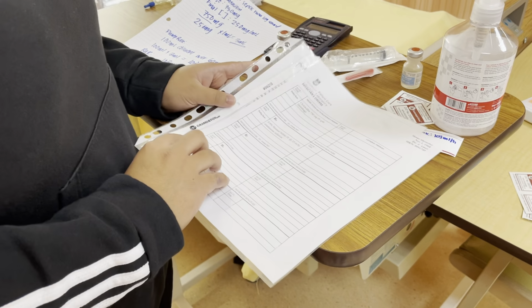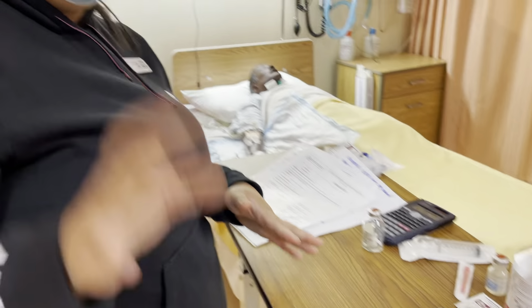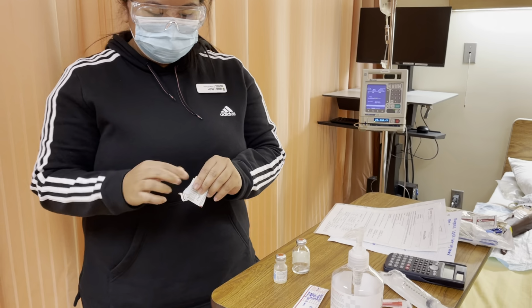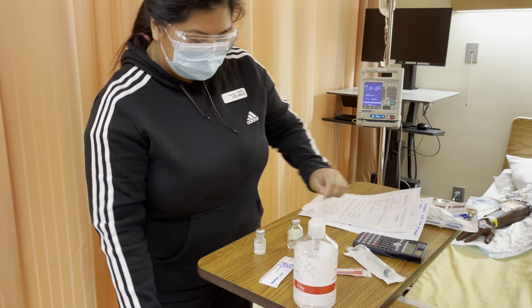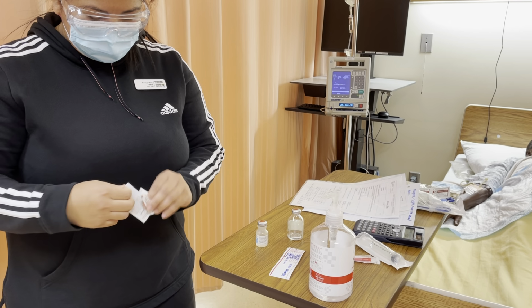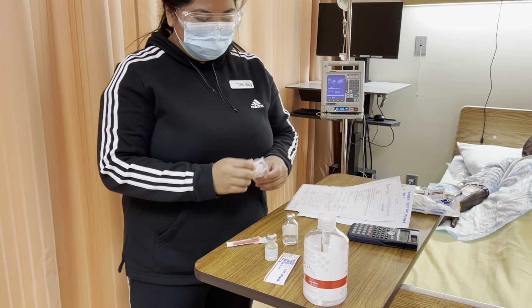So the next thing I'll do is prepare my medication. I'll do another hand hygiene, the whole thing. And then I'll prep my medication. I'll swab this for 30 seconds, let it dry for 15. And same thing with the other one. And then while I'm letting that dry, I'm going to prepare my syringe.